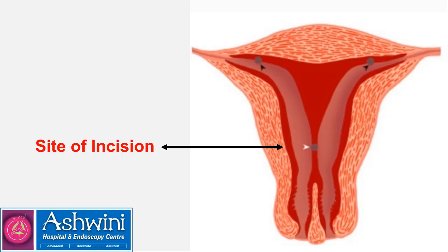We usually post the patient in the immediate post-menstrual period. We don't usually give tab misoprostol as we use a mini resectoscope, an 18.5 French bipolar resectoscope with a Collins knife as the electrode. We usually start the procedure. I usually start the septum incision, the intrauterine septum incision, from the right cavity.